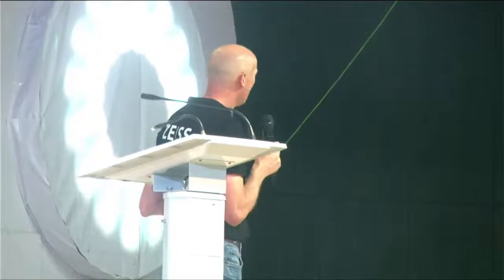Next slide, please. Yeah. So to explain a little bit better, before we were using our eyes like on a train track in vertical direction. So we had the far area, vertical direction, intermediate. We had our reading area and the digital area in the eyes lens already. But now we are no longer with our eyes on a train track. Now we are with our eyes in space.